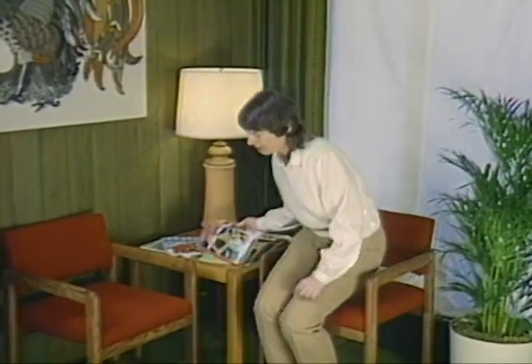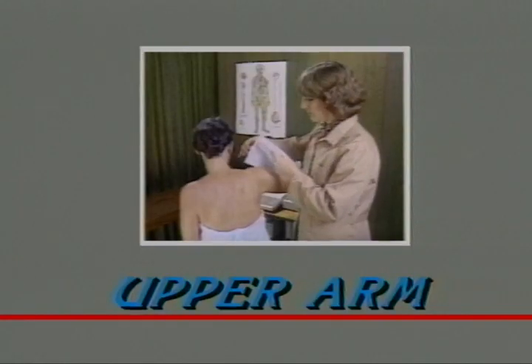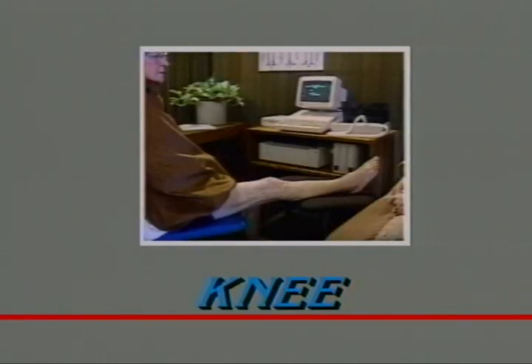The scanning procedure is direct and uncomplicated. First, the patient is placed in a thermally quiet room. That is, a room with no temperature changes or drafts from cooling or heating devices. In the three examples shown here, the patient uncovers the portions of the body to be scanned.